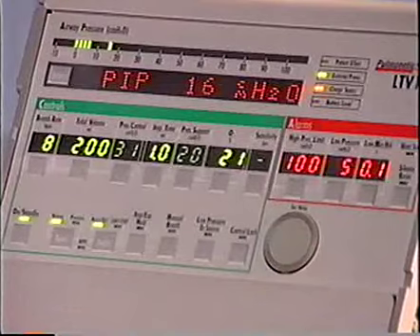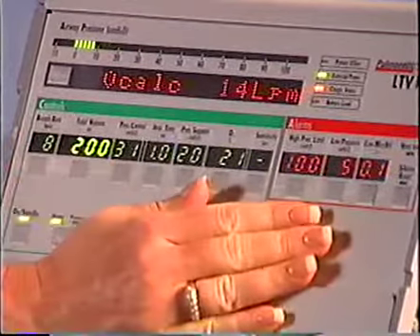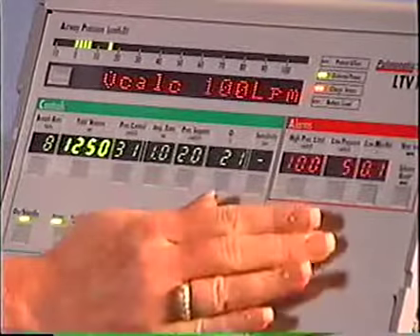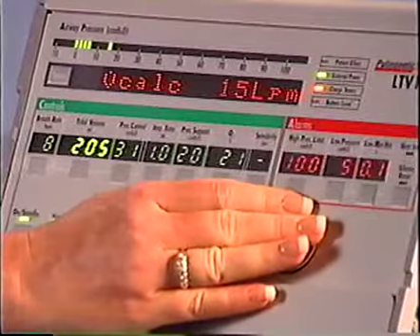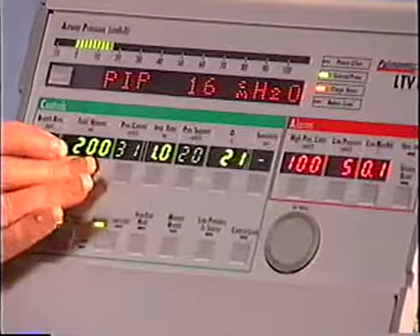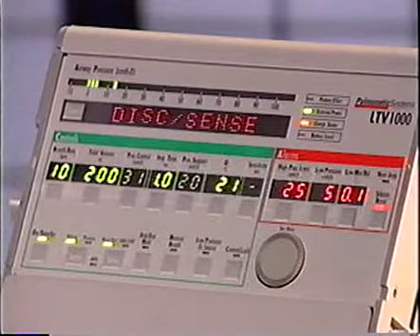When a control flashes, it means one of the following. If you are changing a control setting and the display flashes, you have reached a limited value for the control. For example, you are trying to set a tidal volume larger than the inspiratory flow allows. If an alarm display flashes, it indicates that an alarm has occurred or is occurring.